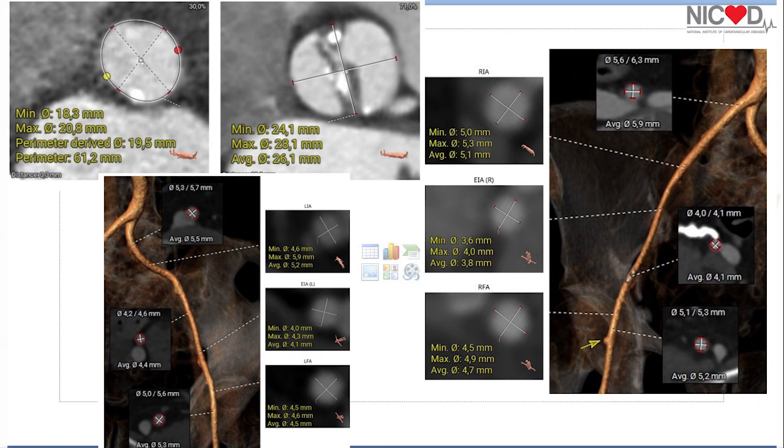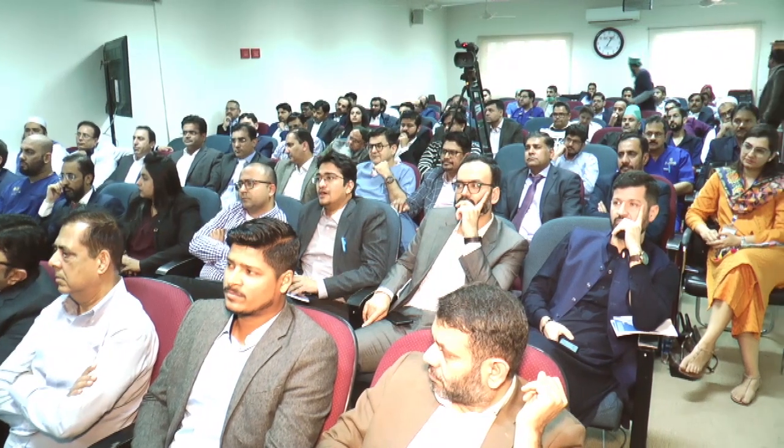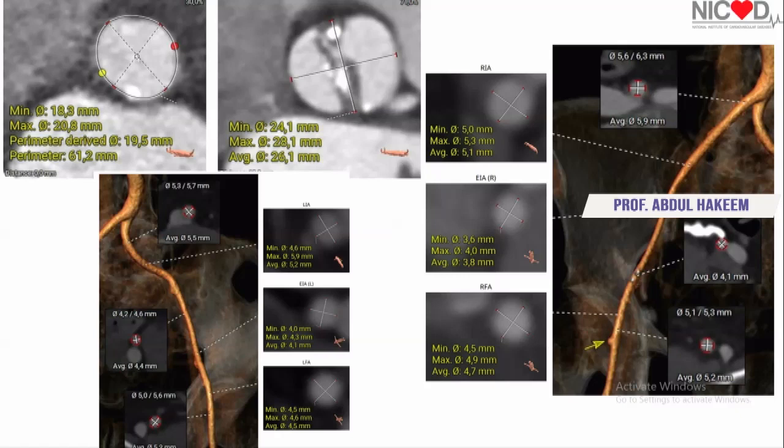But understand that the outcomes of TAVR are most questionable in the D3 variant, because we really don't know if they're going to do well, if the degree of LV hypertrophy regresses, or if their diastolic dysfunction is going to regress by putting in a prosthesis. Okay, so coming back to our patient, yes, she indeed does have that. And Jehangir, why don't you walk us through what we're looking at here, and what we're seeing at the sinus level.